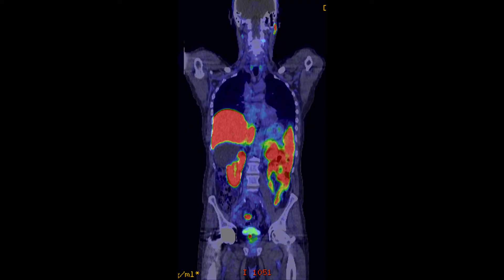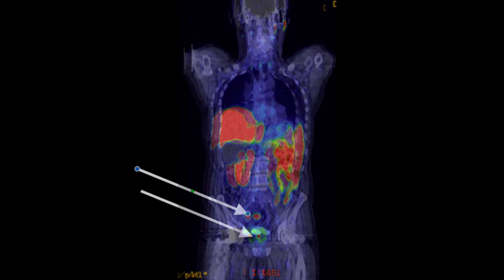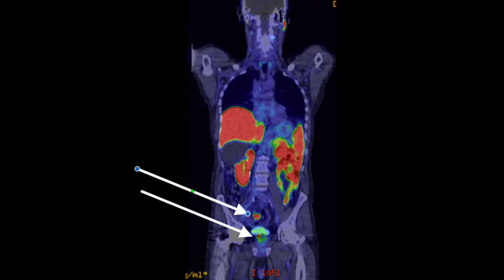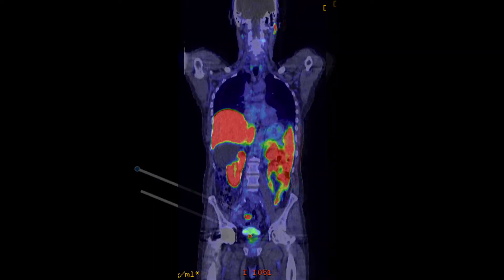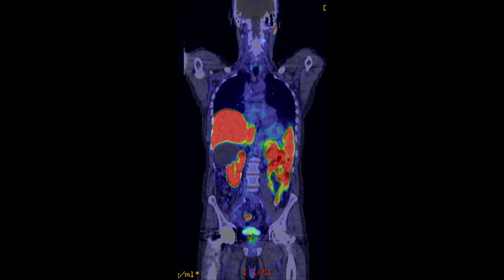This is a PET scan used for the investigation of prostate cancer, used in combination with CT scan. You can see here in this image there are two arrows: the lower arrow shows activity in the prostate which indicates prostate cancer, and the upper arrow indicates a node which is involved in prostate cancer. The other areas in red are normal organs which light up on a normal PET scan.